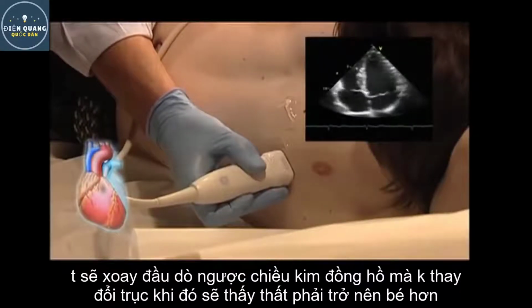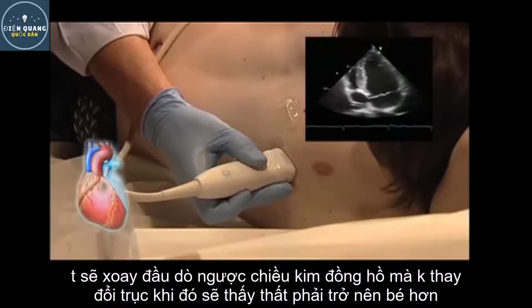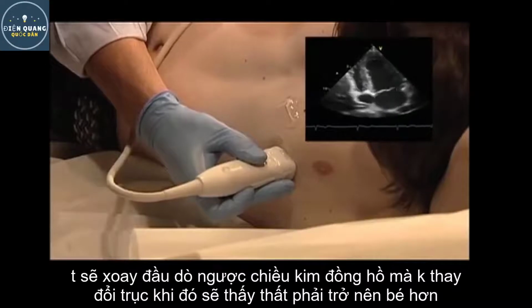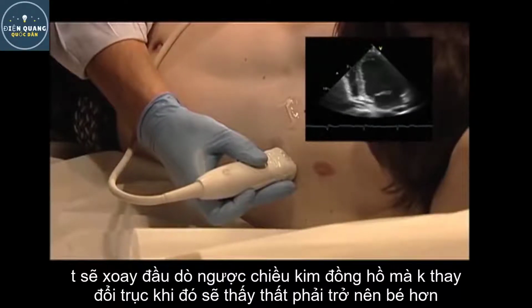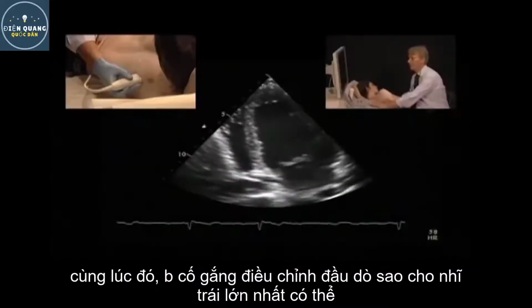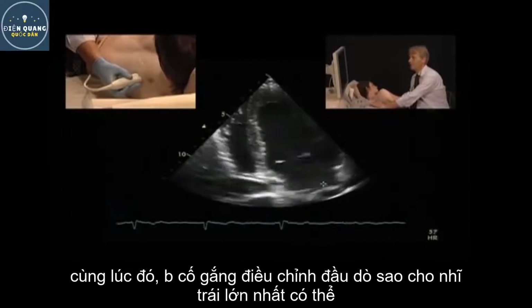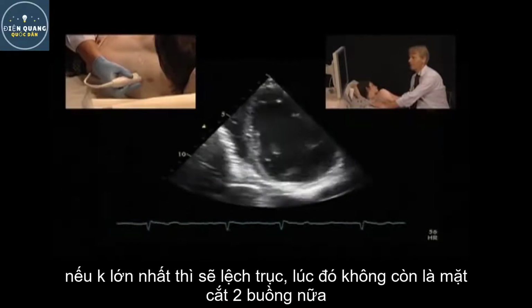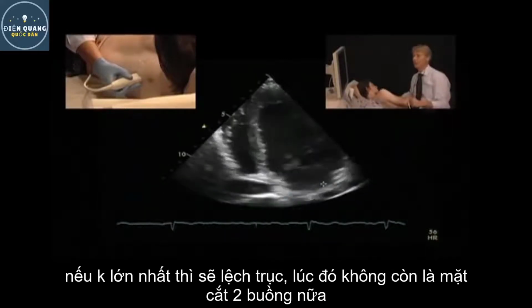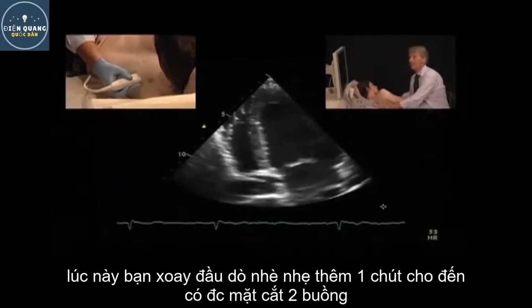Now I will be rotating without changing the axis, slowly counterclockwise, and you will see that the right ventricle gets smaller and smaller, and at the same time you will have to try to assure that the size of the left atrium remains as large as possible. If you lose the size, you will also tilt out of your axis and you will not get a decent two-chamber view. So this is basically just to give you an aid that you're still on track.